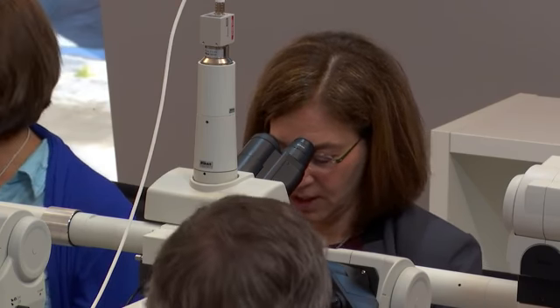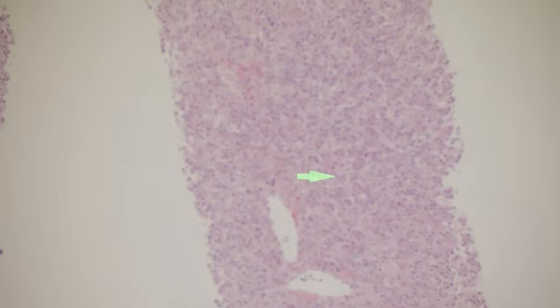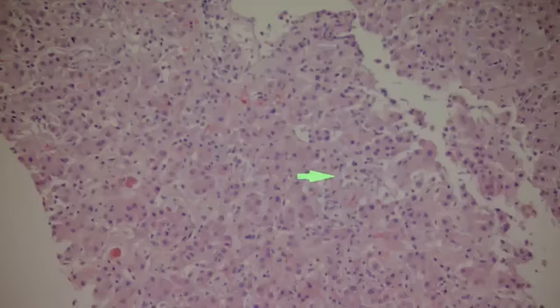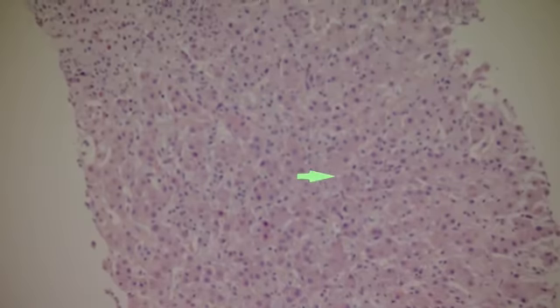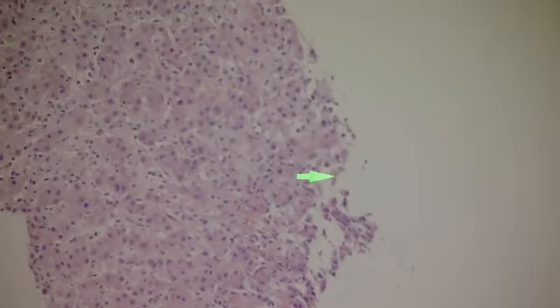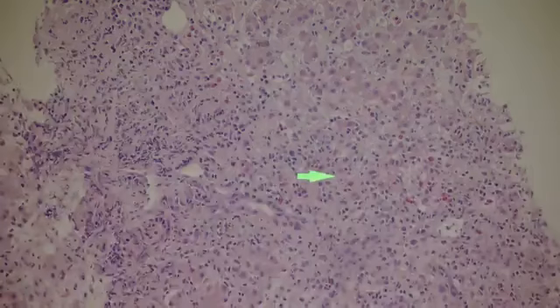And this one is a 35-year-old, and this is another autoimmune. This is a little paler, but what I want everyone to get a good feel for is that autoimmune hepatitis does not have to have primarily plasma cells. It can, and if it does, that's very helpful. But so, same pattern, and all these cases, you might think they look identical. And really, there's nothing here that would help you tell one from another, right? So I think, again, key, this is autoimmune. Now I want to show you one autoimmune that you probably would have picked up on.